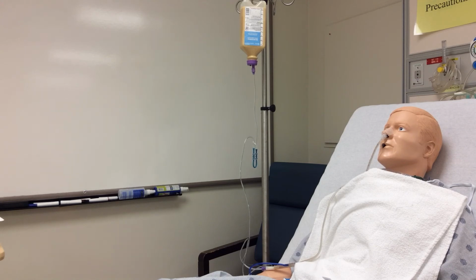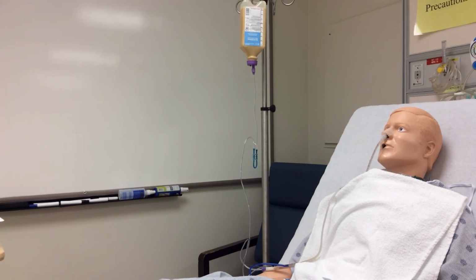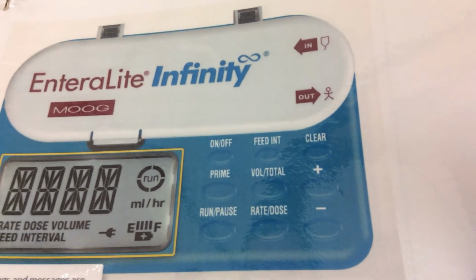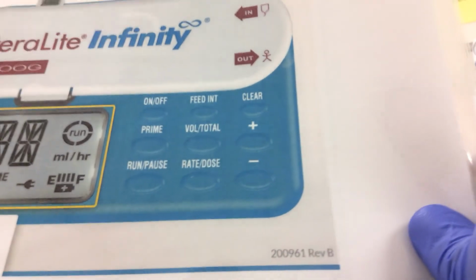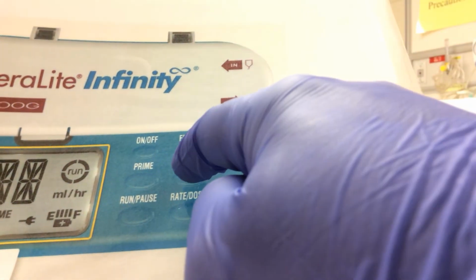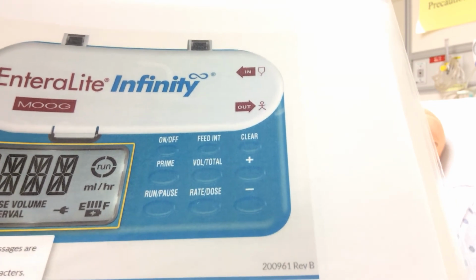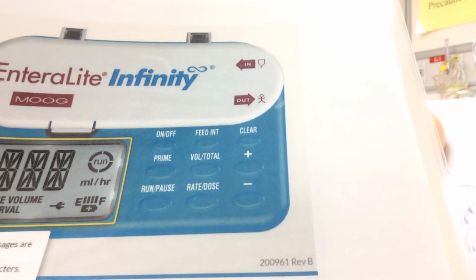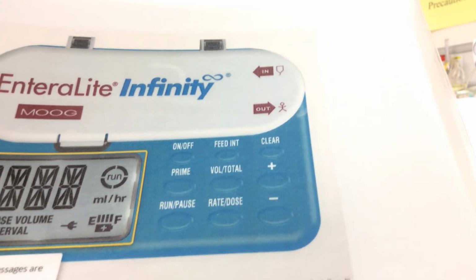Whether you're leaving for a shift or your tube feed bottle has emptied, we want to make sure we're documenting the total amount infused. And the nice part about these pumps is it actually keeps track of that for us. So right here you can see, you can click volume total. When we press that, it is going to tell us how much volume has been infused since it was last initiated or last cleared.